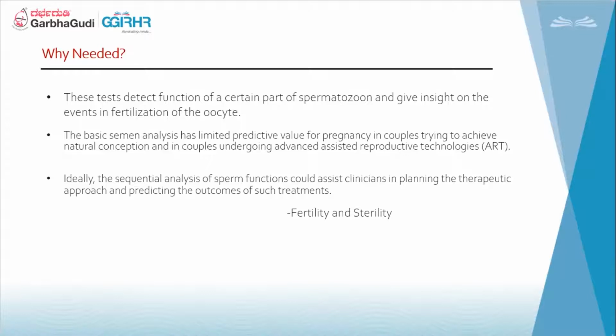It can't give all the things required. It is only telling us specific things. It is not telling us about the vitality, or how the sperm will perform from inside. The functional capacity, we don't know by semen analysis. So we need this kind of tests.